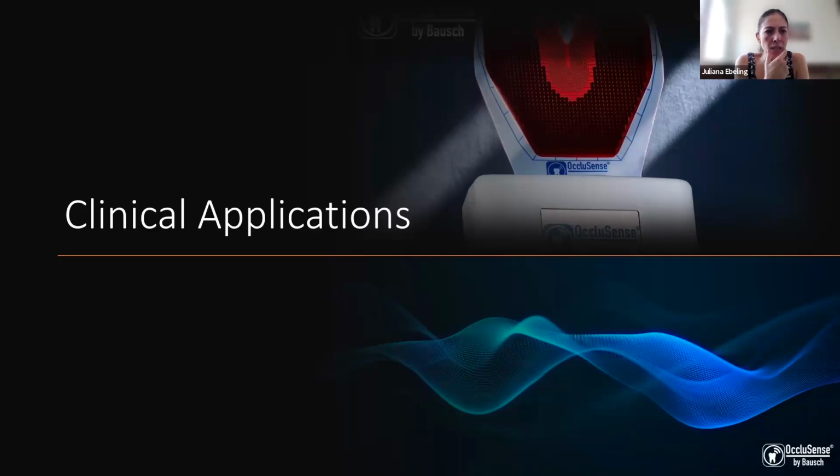When you use the sensor, it has color, and this color is transferred to the teeth. And I can correlate this. It's exactly like a paper. I have the marks, and I can correlate that mark on the tooth with the graphic. All right. You can do this correlation. Thank you.